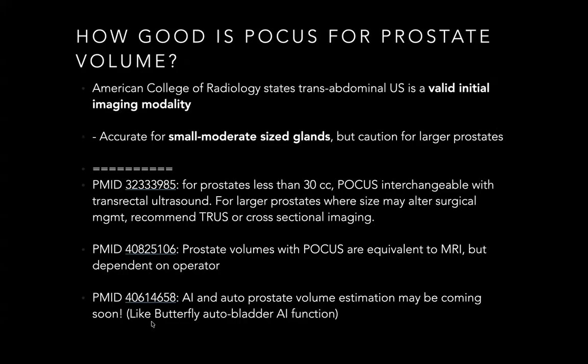And we will talk more about the Butterfly auto bladder AI calculator function of the bladder volume, but there may be an auto prostate volume estimation coming soon. So it's important to know how to do this so that you know how to manually do it. However, there are AI solutions coming soon, and so potentially that will make things a little easier. So all in all, fairly good for prostate volume.